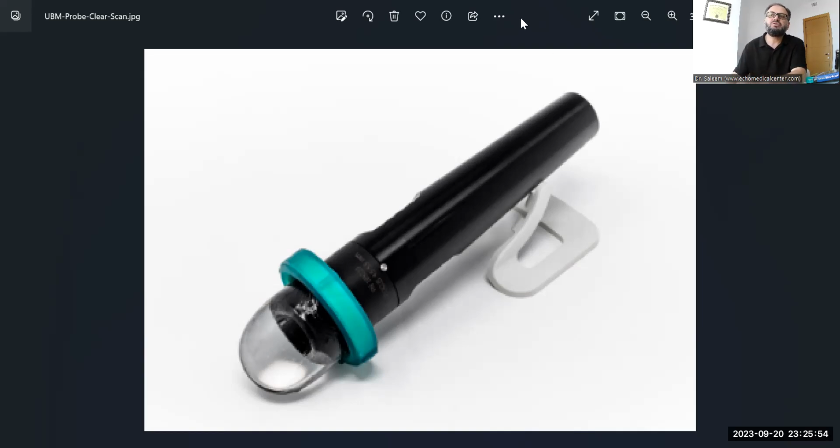Now, the other solution is, for example, if you cannot buy this transducer or it's not available, or it's not compatible with your machine or something like that. So another easy, simple way, with no cost, very cheap: put a lot of gel, like too much gel, make a big bunch of the gel, and then put your transducer on top of the gel.